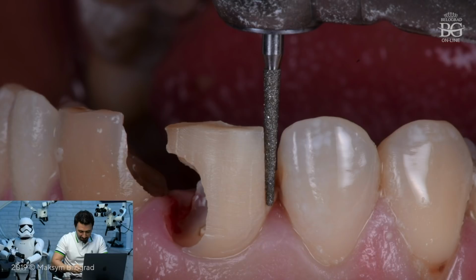Just take a look. The level of the defect corresponded to the level of the gum. It's really, really subgingival, a super subgingival defect, and the biological width is there.